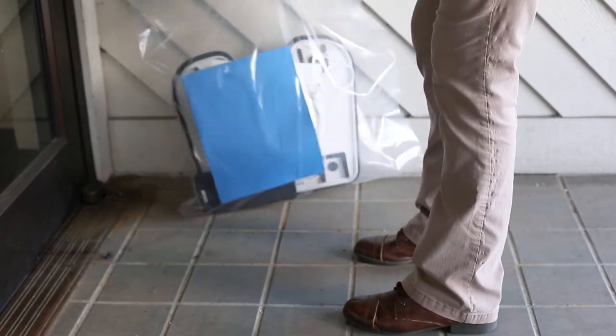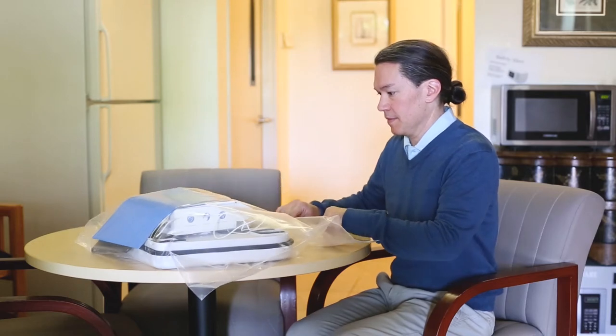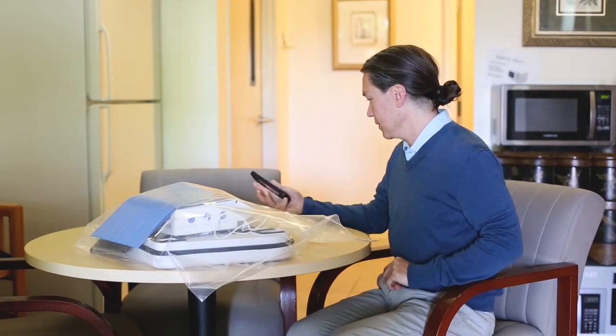You will receive your remote monitoring equipment delivered to your doorstep in a plastic bag. Please bring in equipment immediately after being dropped off, and a member of the remote monitoring team will be contacting you shortly to walk you through the process.